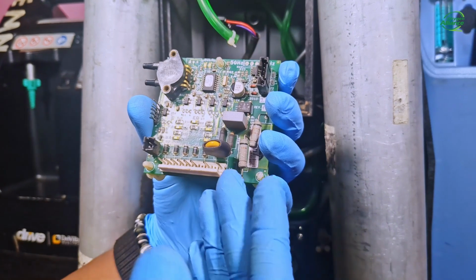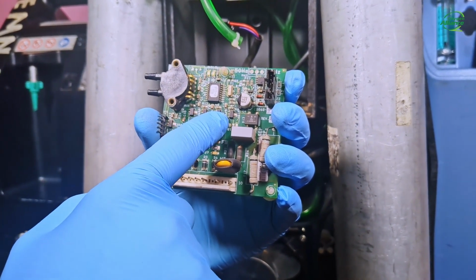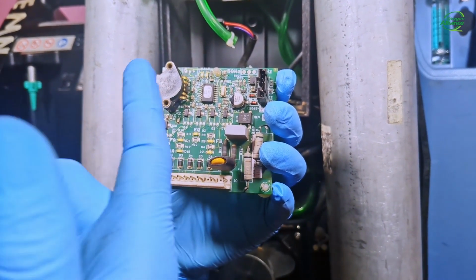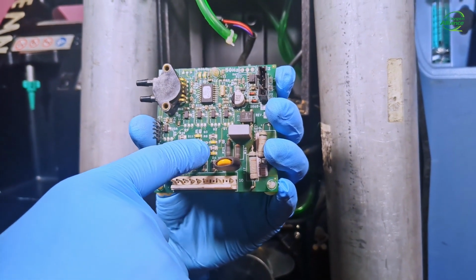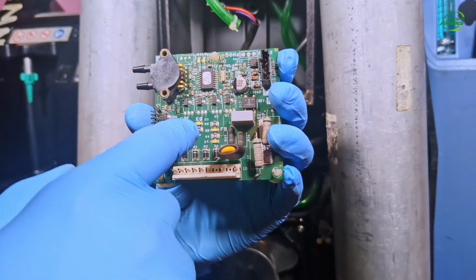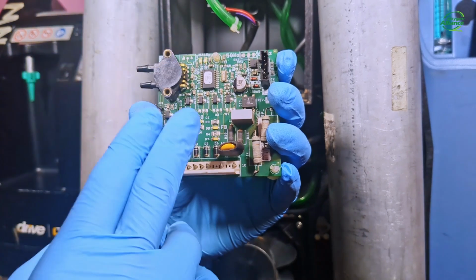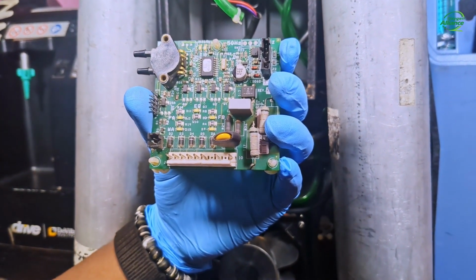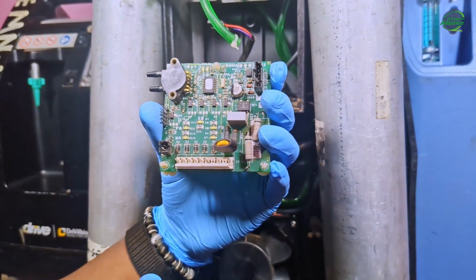So one easier solution can be to replace this transistor if you have the right tools. In other cases, it is not the transistor that is damaged. It can either be the resistor or the LED itself. So mind you, you have to carry out these checks when you have verified that your valve is working okay and that the cables are not damaged.